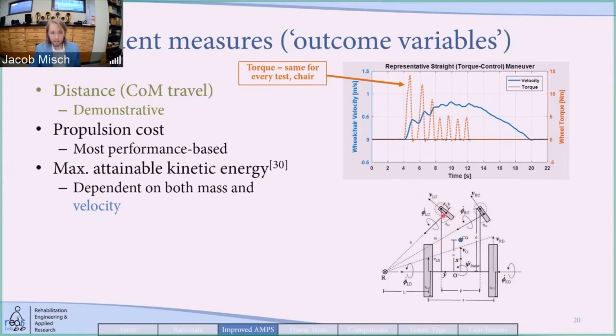And we use a series of equations that I'm not going to show here, but in general, we take a look at the rolling of the drive wheels and the casters, as well as the swiveling motion of the casters and the entire wheelchair itself as it turns about its center of mass. And we include, of course, the linear translation of the mass of the system in this kinetic energy equation.